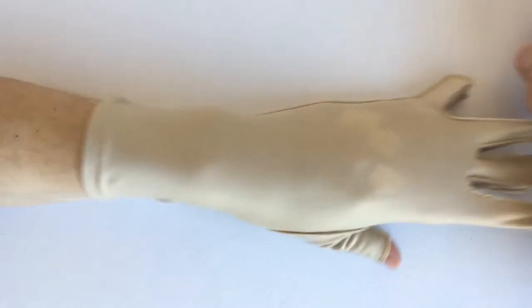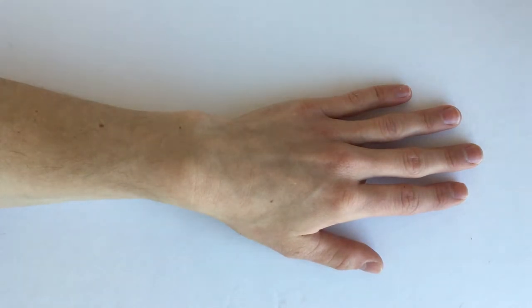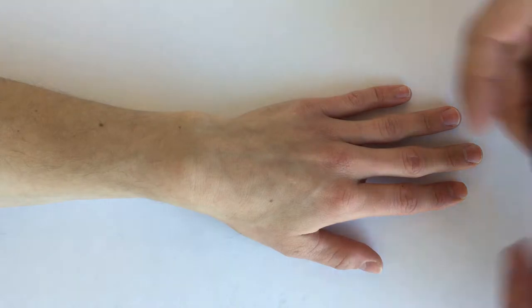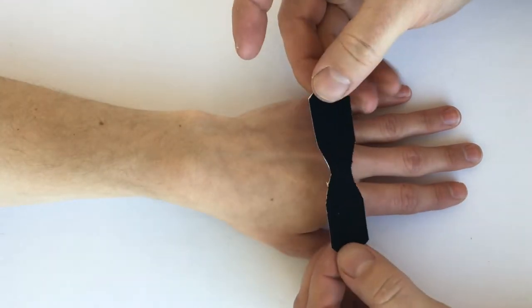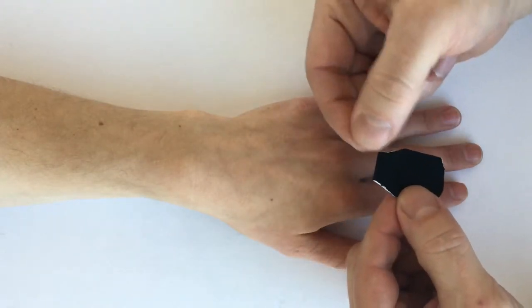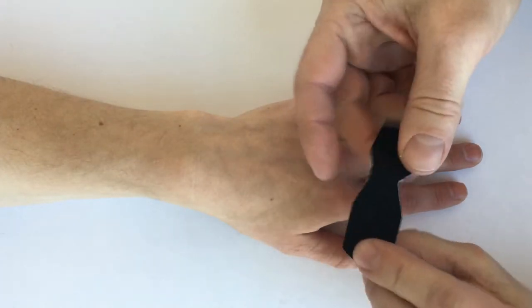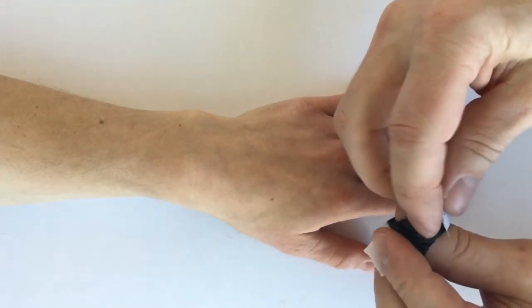Another way to provide some compression in those web spaces is with some kinesio tape. So what I do is I just use a four inch long piece of kinesio tape, cut it one inch wide, fold it over to cut it into an hourglass shape, and then put those on each web space.